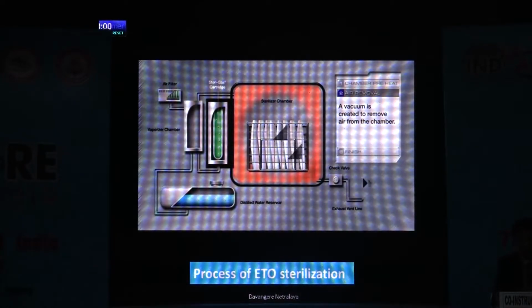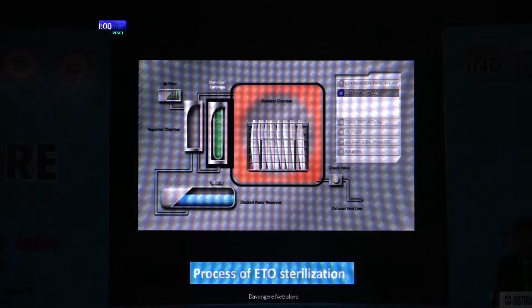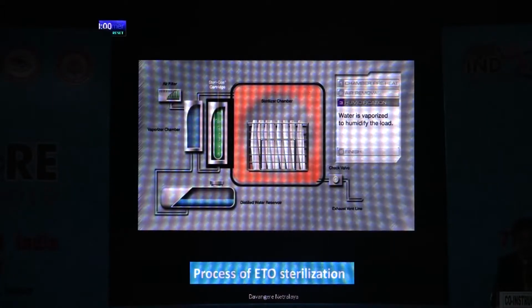Make sure that complete air removal is done. Then you have to humidify the load. Once you humidify the load, the humidity is a very essential thing, so that the water is vaporized and you get an ideal optimum humidity for the effective cycling process.